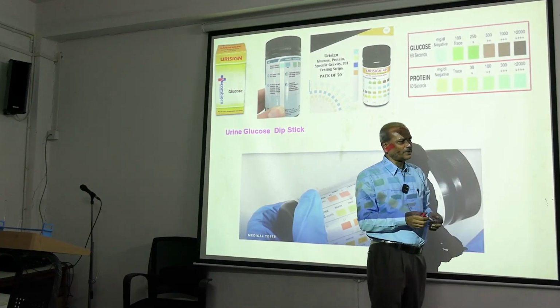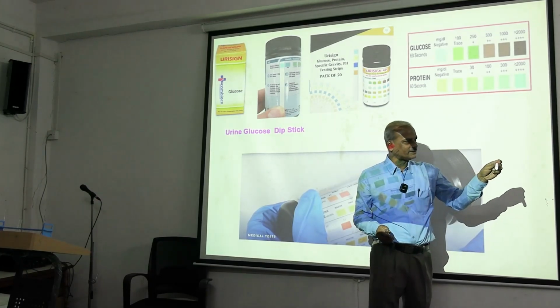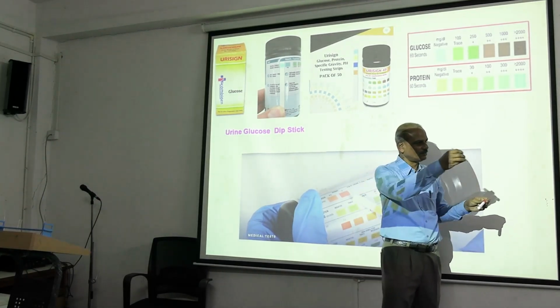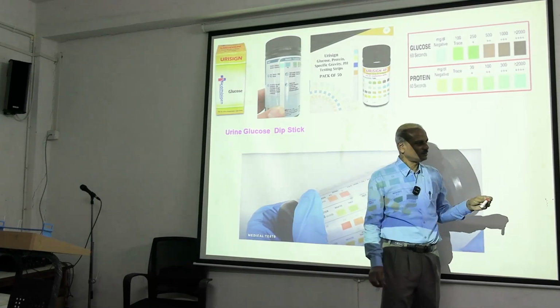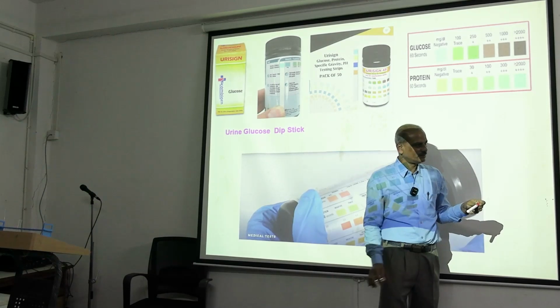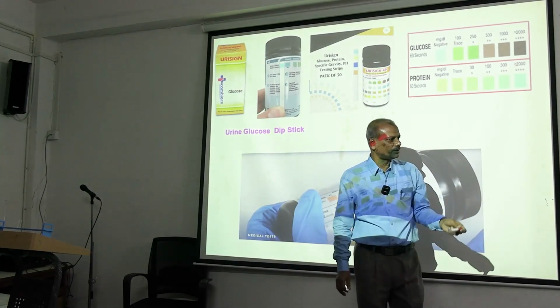Many times the patient is given that strip, asked to hold the strip like this, pass urine directly on it and bring it to the laboratory. That way there is no requirement of giving a test tube, because washing will be a big issue, or you have to discard it. So it is better to ask the patient to go to the toilet and bring it. You will note down the time, as 1 minute will be there.